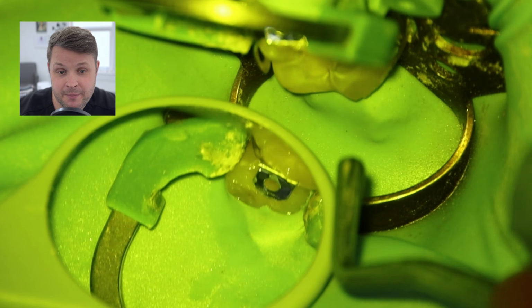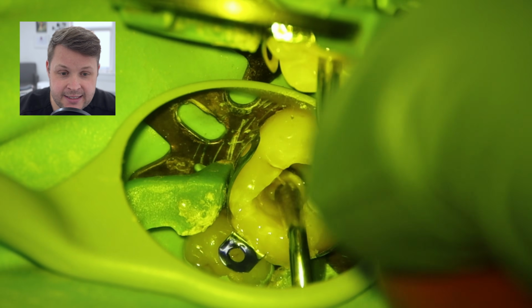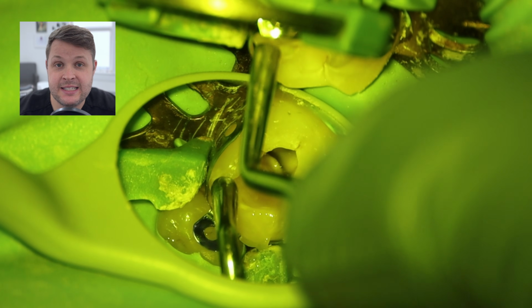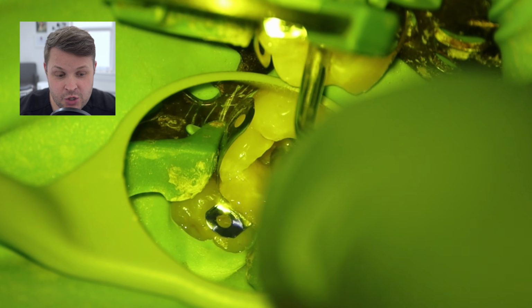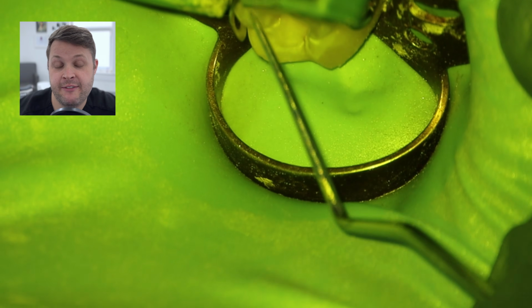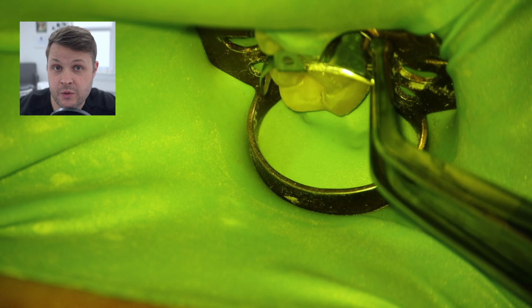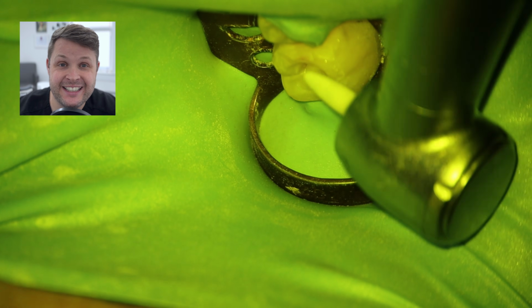The first reason, of course, is there's a possibility that you do the root canal and then find the tooth is unrestorable. Another reason to make sure that the cavity is good and solid is because when you are doing the root canal treatment, I personally like to fill the cavity up with irrigant, and this creates a nice reservoir for irrigant to flow into the canal spaces to disinfect the canals, but also to cool your instruments as they're rotating in the canal space.